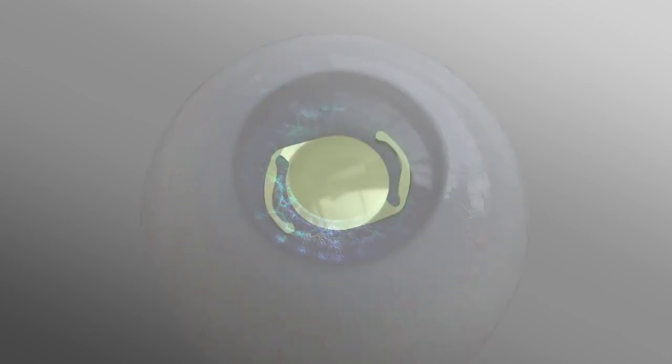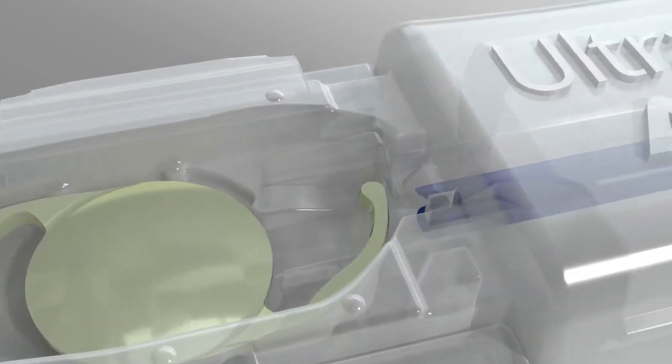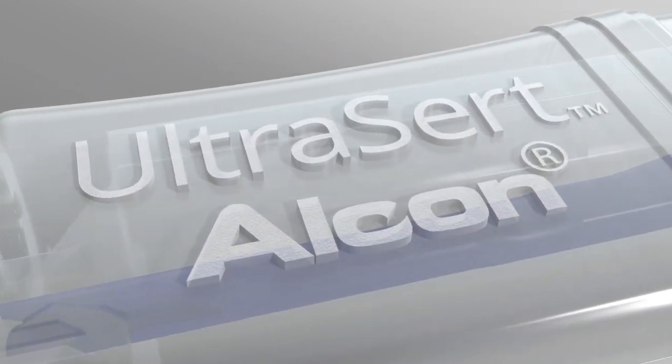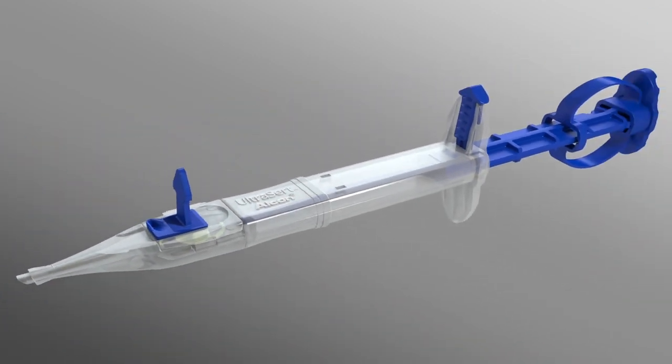In cataract surgery, the moment of implantation is crucial. For complete confidence, you need a delivery system built with your needs in mind. Presenting the Ultrasert preloaded delivery system from Alcon.